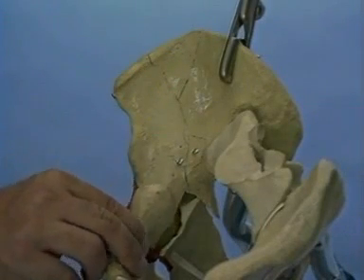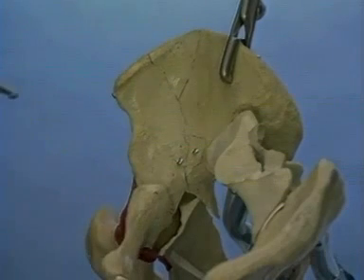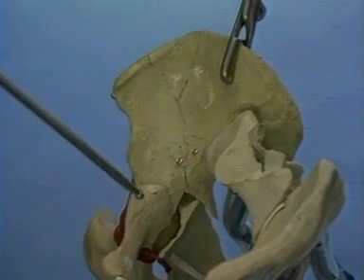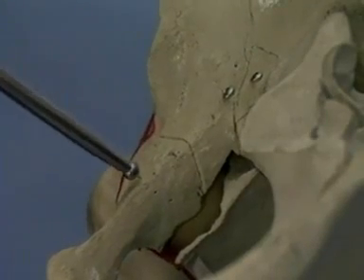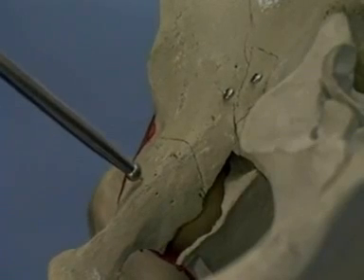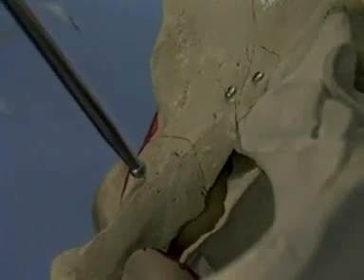The lower portion of the anterior column is reduced by pressure from the ball spike. For this exercise, the reduction is held with a pointed clamp, though this positioning of the pointed clamp would be impossible through the ilioinguinal approach.